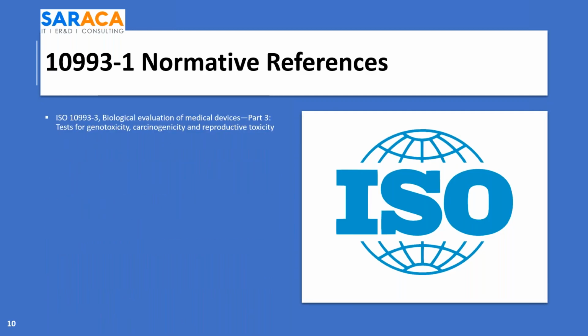Sam, this is a very important point you are bringing out here. Does it mean all the materials that can potentially be exposed to the body need to be assessed for biocompatibility? Only if your risk assessment indicates that there's a possibility of breakage, which will expose a new material to the body tissues.